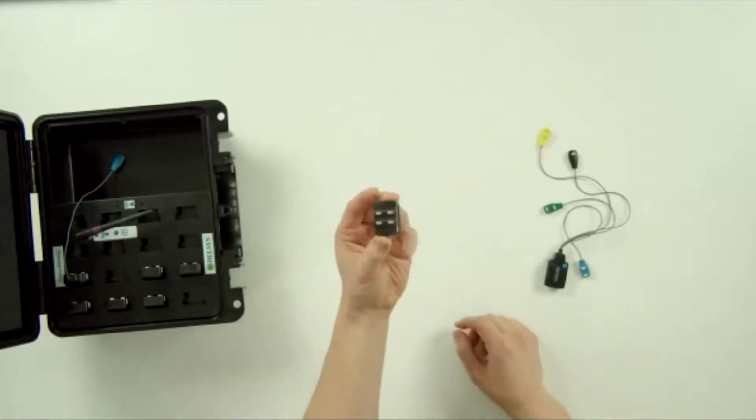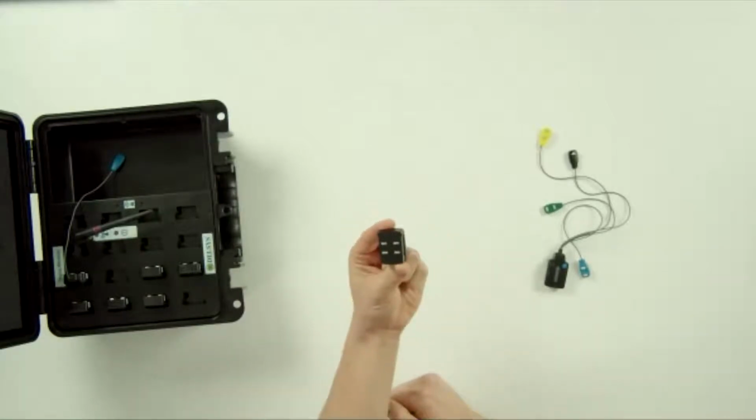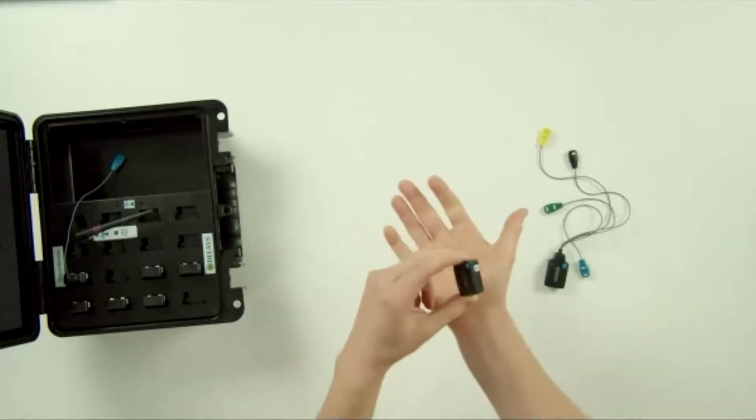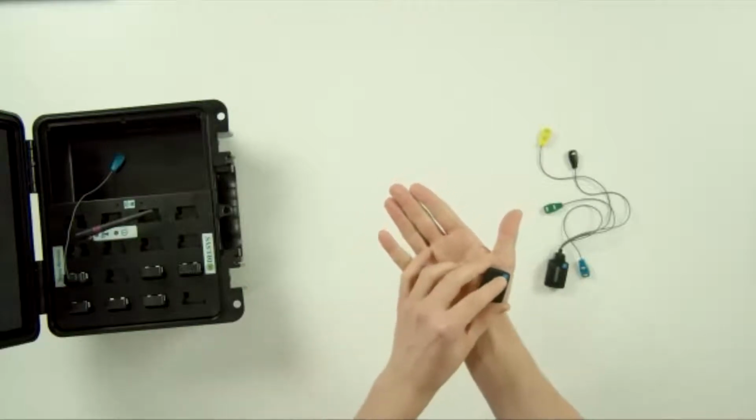The Avanti sensor is perhaps seen as our standard sensor. So there are no cables attached to this sensor. The EMG electrodes are on the rear of the sensor next to our reference electrodes. We apply this to the surface of a muscle on the skin using some double-sided adhesive.